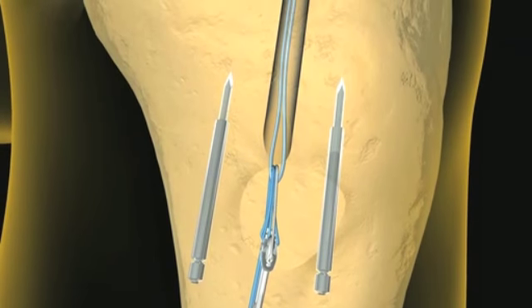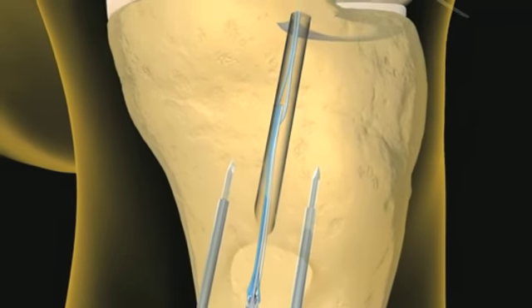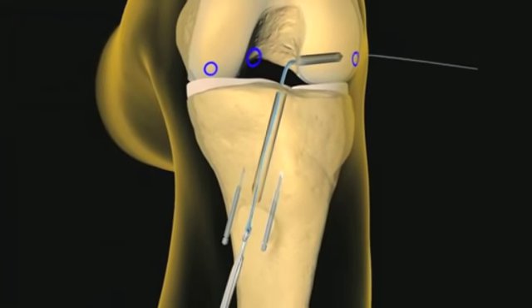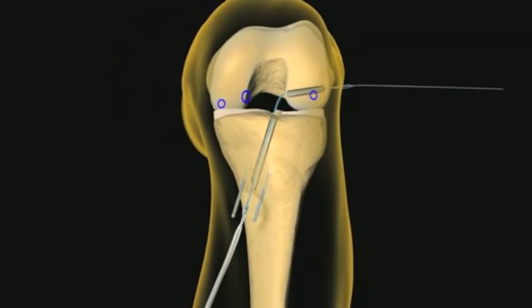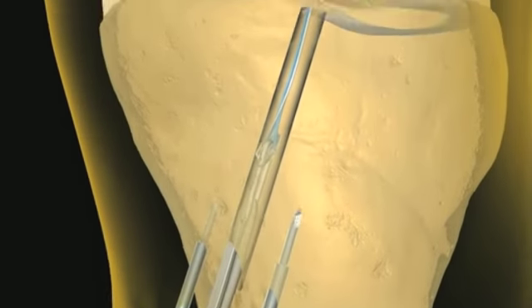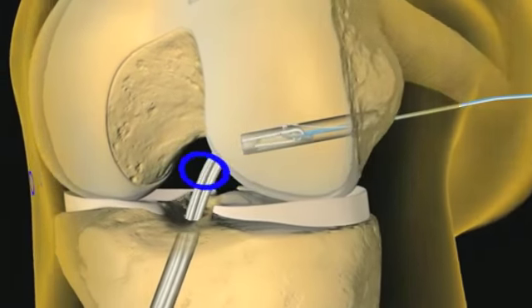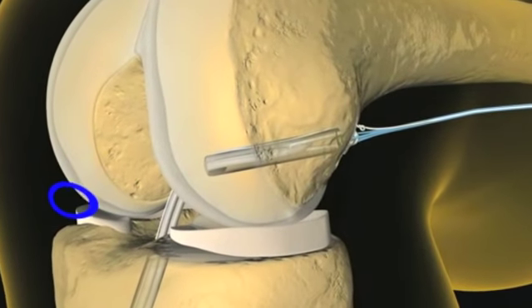With the suture loop exposed externally, load the suture strands of the ExoButton loaded graft into the passing suture loop and pull them through the femoral tunnel, making sure to keep the graft construct outside of the tibia. Pull the ExoButton loaded graft into the joint and through the femur while hyperflexing and elevating the knee to ease the graft passage. Finally, ensure that the ExoButton has flipped and is seated.